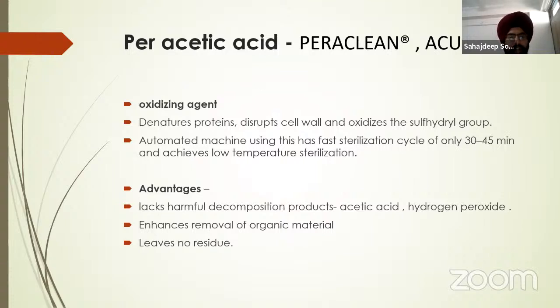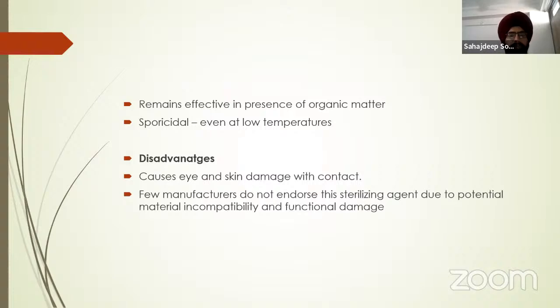The advantage is it lacks harmful decomposition products like acetic acid or hydrogen peroxide, and it enhances removal of all the organic materials, and it leaves no residue. And it is effective in presence of even organic matters like blood and tissue.